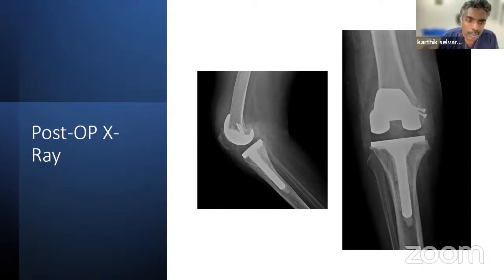The epicondylar osteotomy has become more of a condylar osteotomy, because we take a thick slice. It has never been an epicondylar osteotomy. It is just the name, but it is actually a condylar osteotomy. We take a very thick slice so that fixation becomes easy, and as you can see the line here, it has gone up to here. That's how we have to do that.